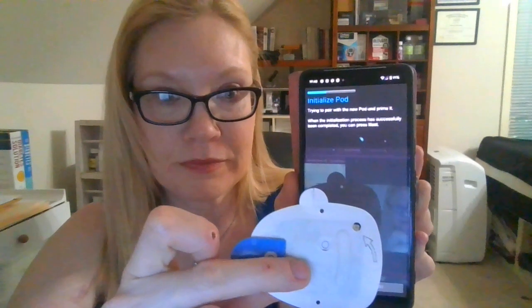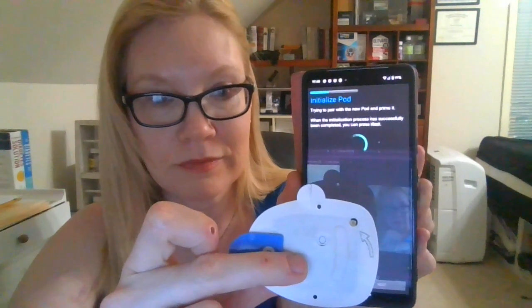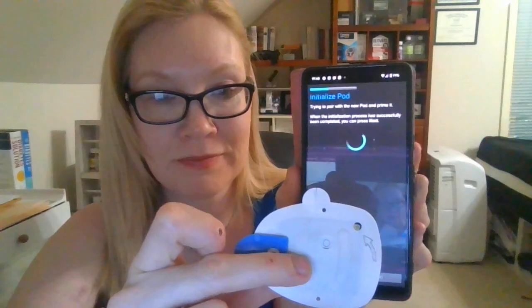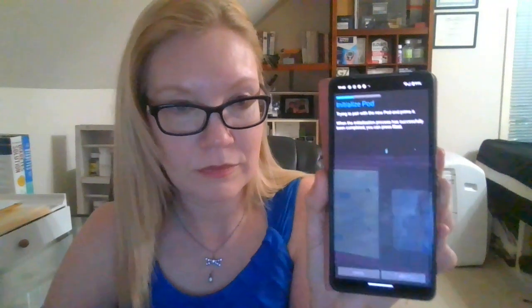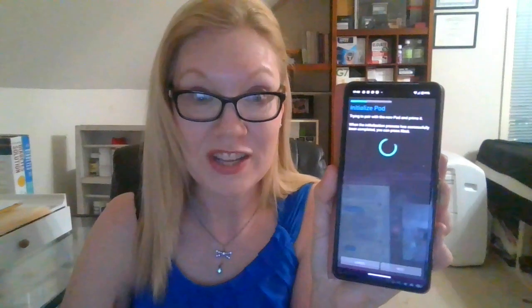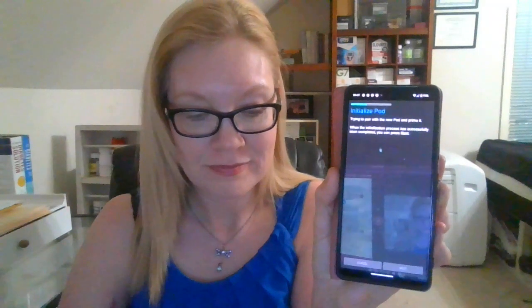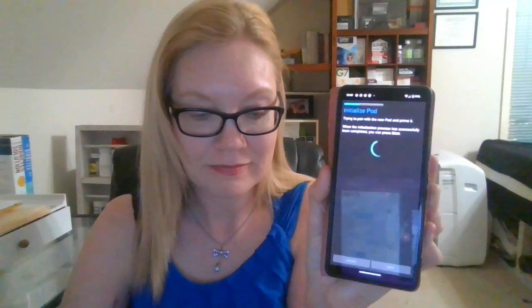This is the same sound you're going to hear when you're getting a bolus. And it's just priming the pod right there — it takes a minute. Okay, it's stopped priming now.